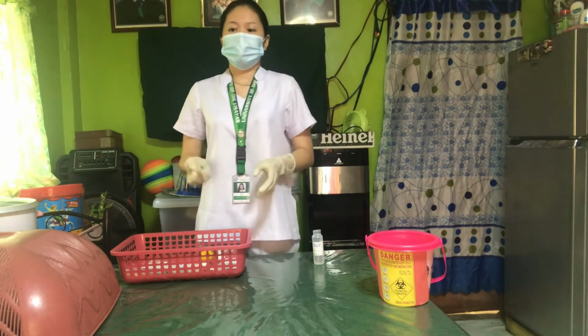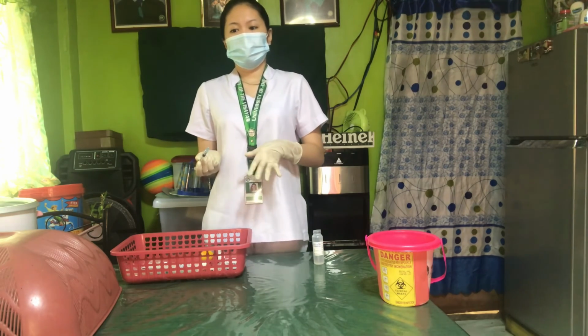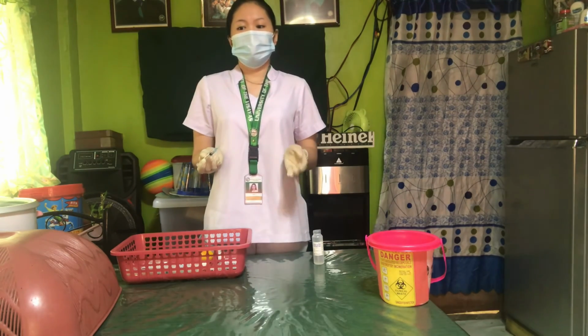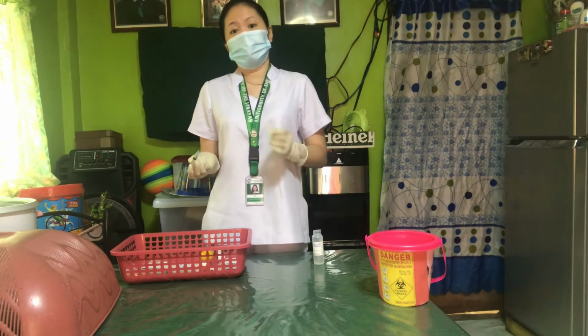So after which, we will put the filter needle into the cap again, and then we are going to remove the filter needle and then insert the syringe again to the original needle, which is used to administer the medication to the patient.